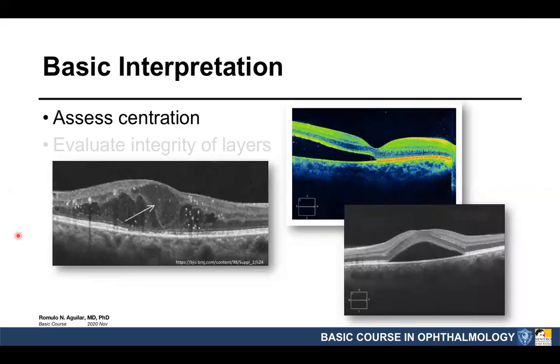For example, if you have severe macular edema, you have retinal detachment with macular off, you have central serous retinopathy, you will see the tapered appearance still. And just let me emphasize, there, here, and there. So if you see that, you know that the scan is centered on the fovea.